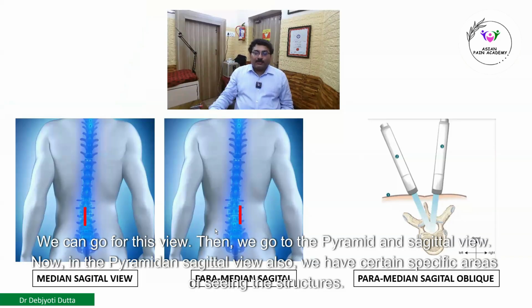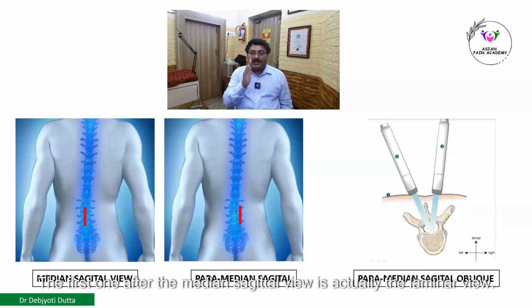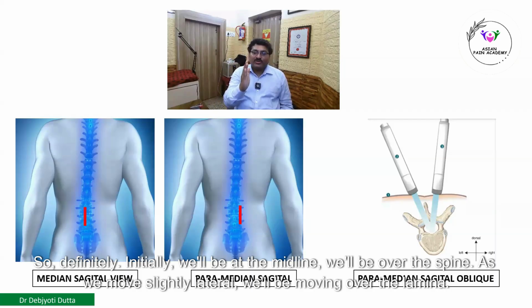Then we go to the paramedian sagittal view. Now, in the paramedian sagittal view also, we have certain specific areas of seeing the structures. The first one after the median sagittal view is the laminar view. Initially we'll be at the midline, over the spine. As we move slightly lateral, we'll be moving over the lamina.